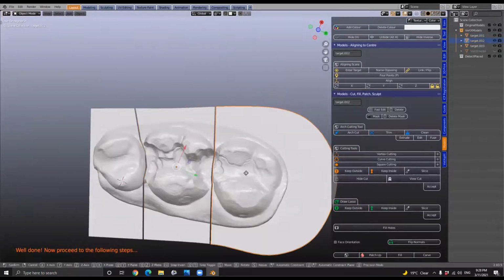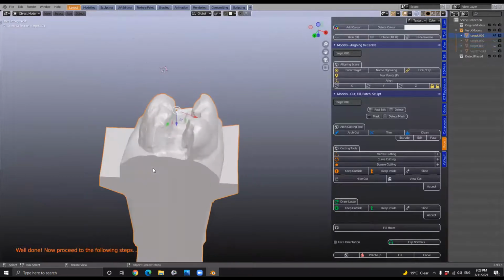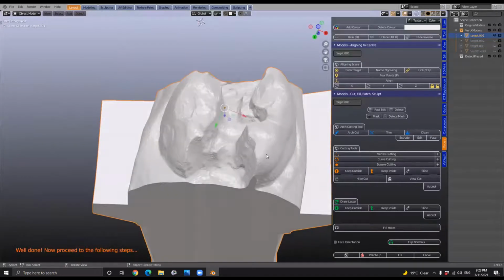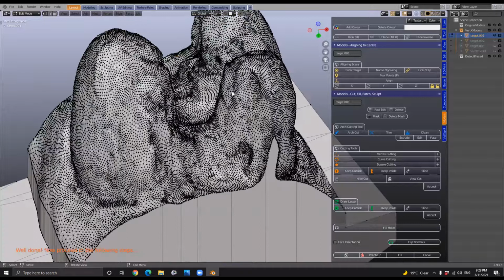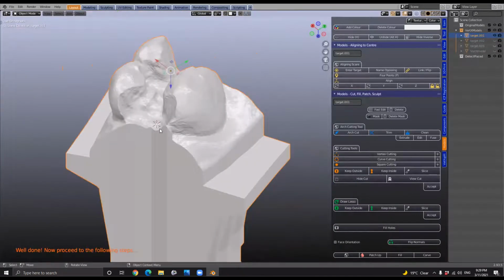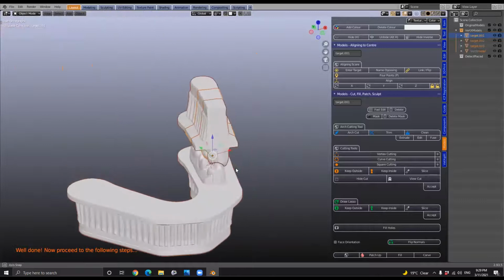And if we do make an inlay like this, so let's just hide this and hide this. I have made a video that the geometry, I mean, the scan, I don't know where it comes from, what type of scanner, because it's quite rough. We would then smooth down this edge a little bit as well, and this edge down as well a little bit. But yeah, this is a good way of doing it as well.